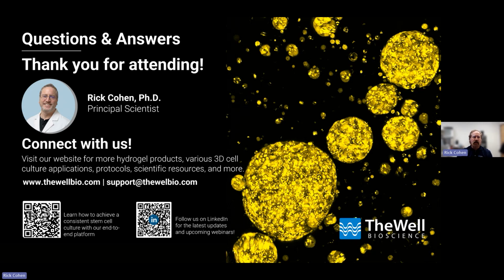You wouldn't want to have your weekend-free at the end of your 7 days. You would have to put in a lot more media. Now, even though our imaging dish does allow you to put in more media than a regular standard culture plate, I would feel uncomfortable advising you that way. So again, start off with the low amount, and it will support both embryonic stem cells and iPS cells.